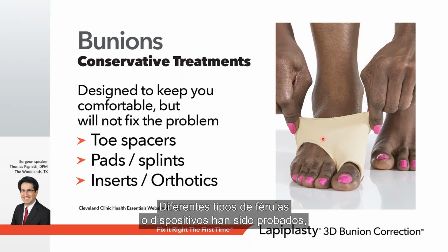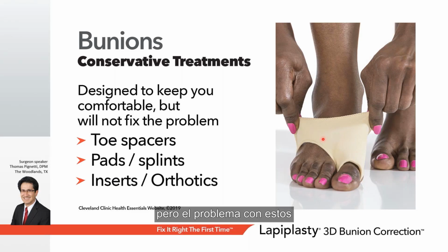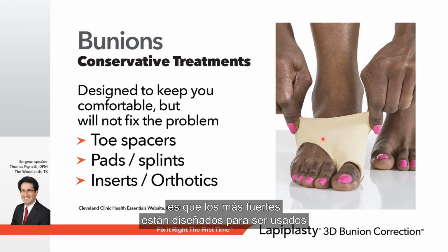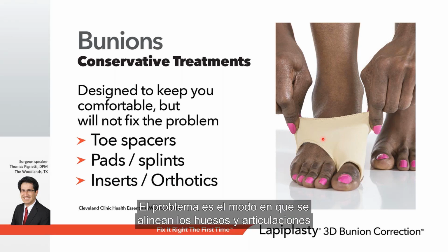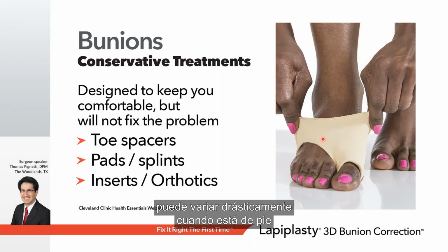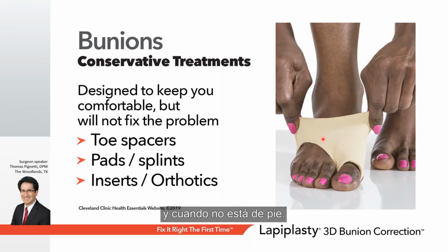Now, different types of splints or devices have been tried, but the problem with these is most of the stronger ones are actually designed to be worn when non-weight bearing or when you're off your feet. They're quite bulky. The problem is how your bones and joints are aligned can vary dramatically when you're on your feet compared to when you're off your feet.